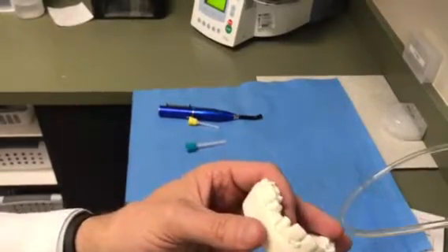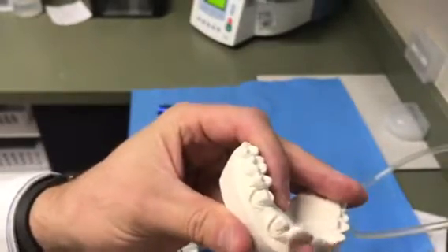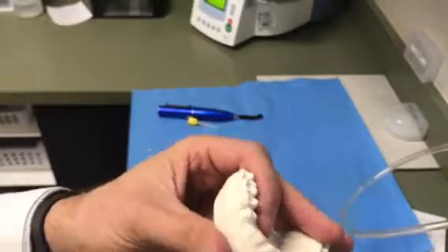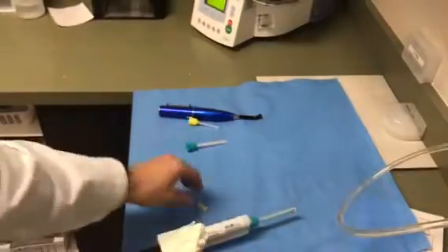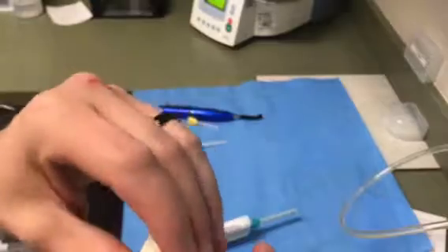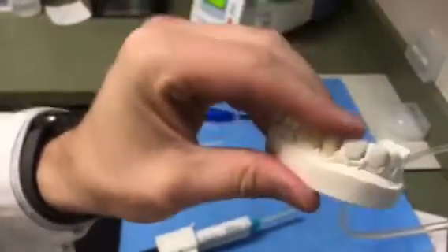I'm usually not that precise, and I don't own any of those, but just as a heads up, you could use those little tabs with tons of different thicknesses until you had a match, and then you're sending the lab exactly what your situation is in the mouth. But I usually eyeball it, tell them to add plenty, add at least that much, and send it back. I'd rather shave off on round 2. But anyways, that's the quickest and easiest way.